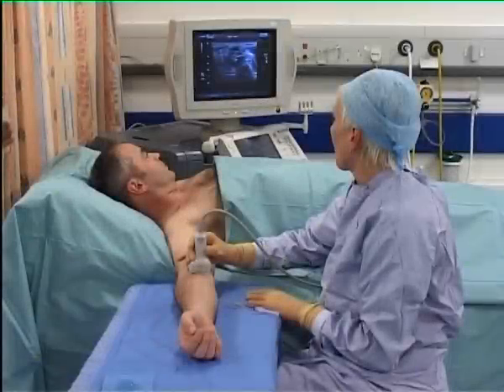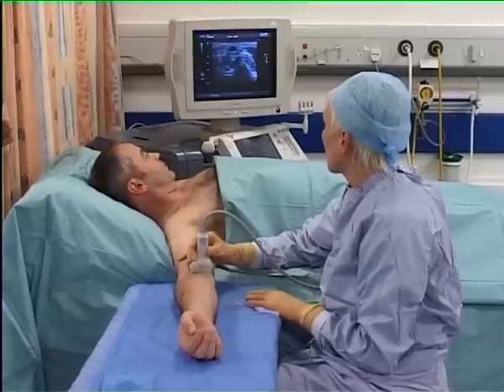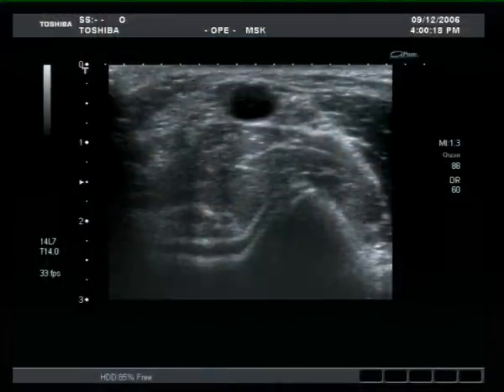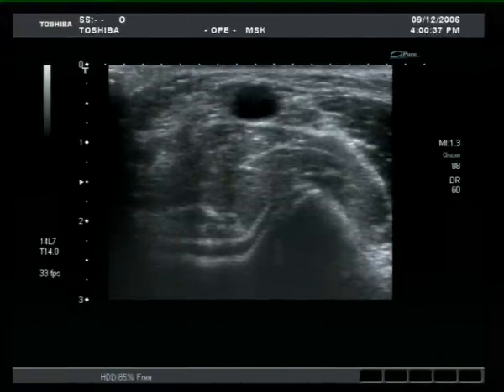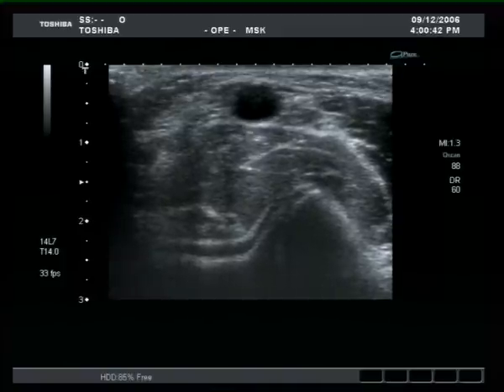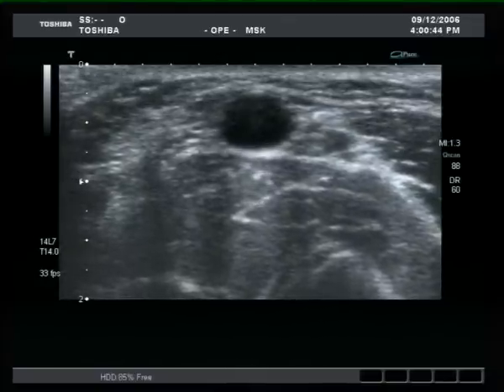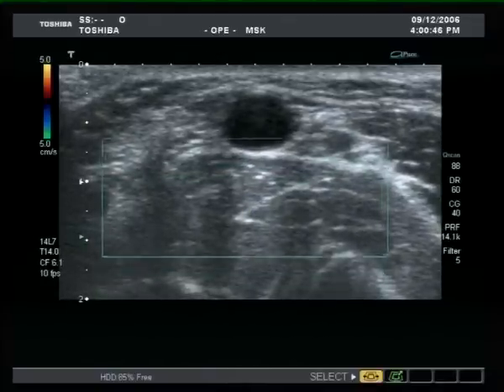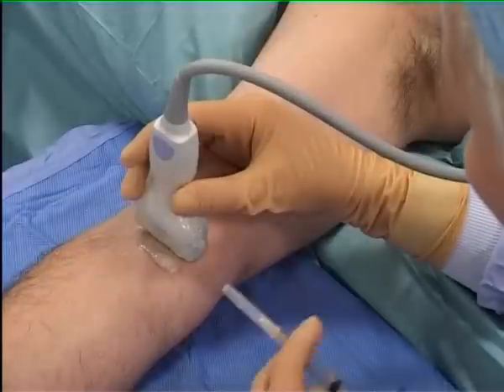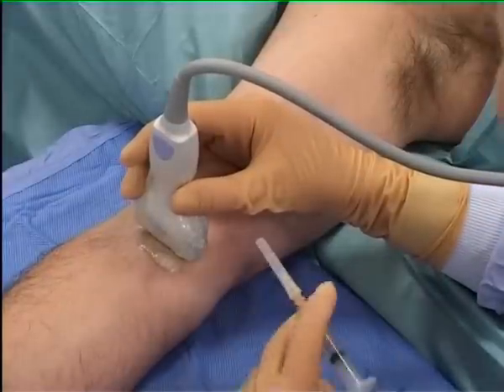The median nerve lies medial to the brachial artery at the antecubital fossa and is therefore best approached from this side. This is most comfortably done with the arm extended on a table in front of the operator. The key internal landmark is the brachial artery, which can be readily identified as a pulsating structure at the top of the image. We reduce the image depth to 2 cm and use the Doppler function to confirm the identity of the brachial artery. The nerve lies medial and adjacent to the artery.